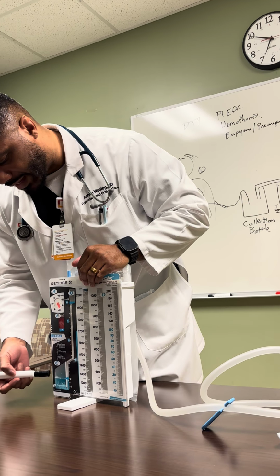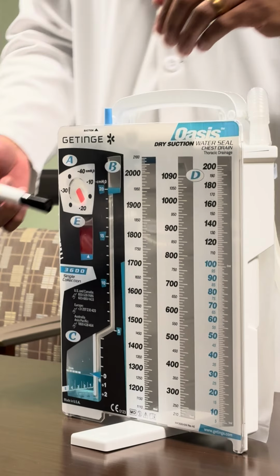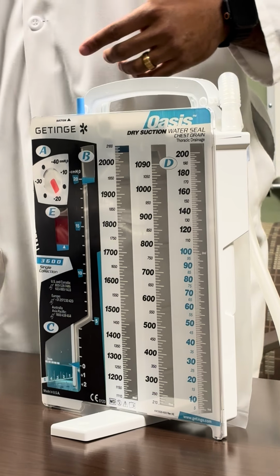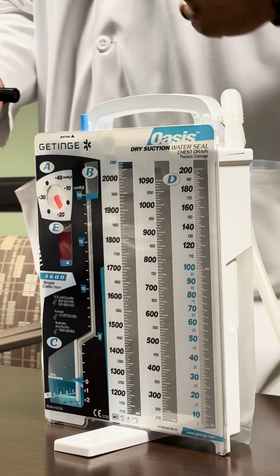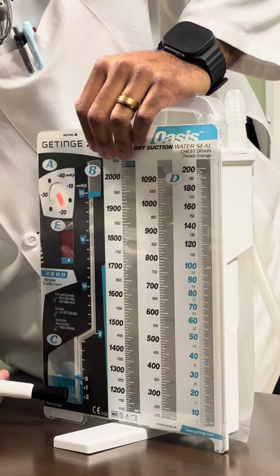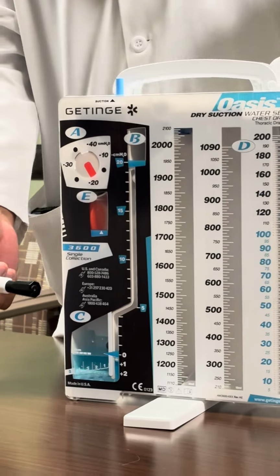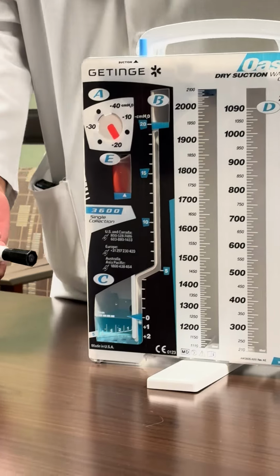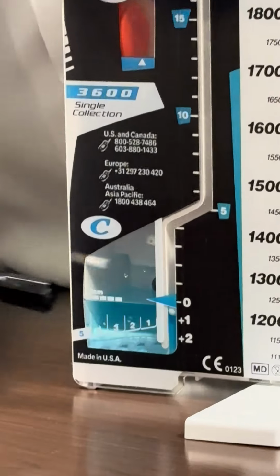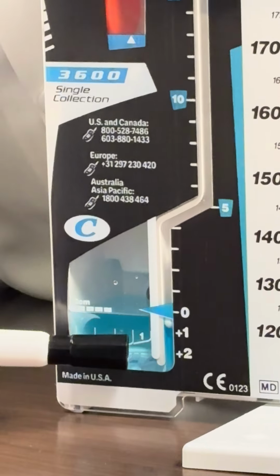The other thing that is good to take a look at is your air leak chamber, making sure that there is no new air leak going on, and how severe the air leak is. You can see that there are levels to this, right? So you have 1, 2, 3, 4, 5. Somebody with just a small little air leak, like a little occasional bubble or two, usually reaches this number 1, as opposed to somebody with a moderate air leak.